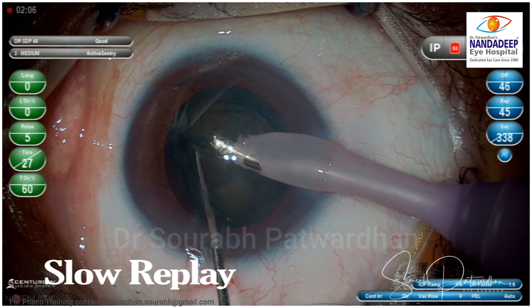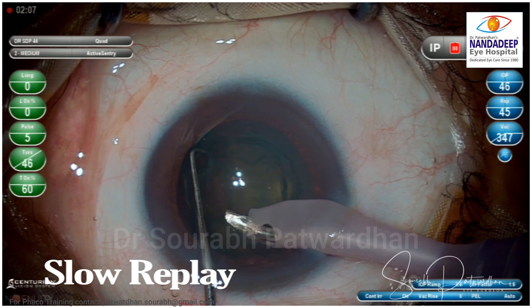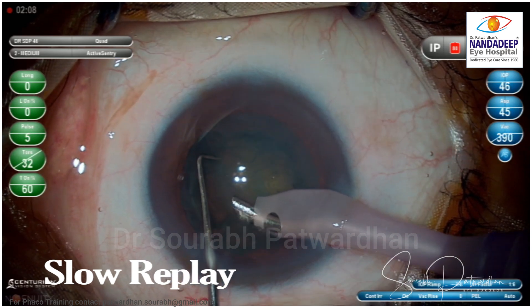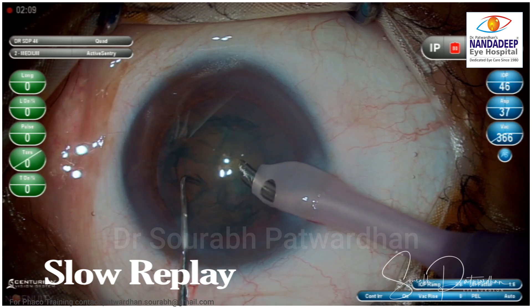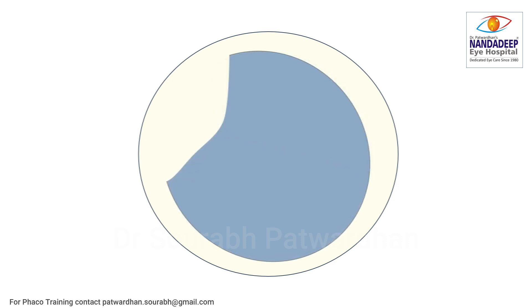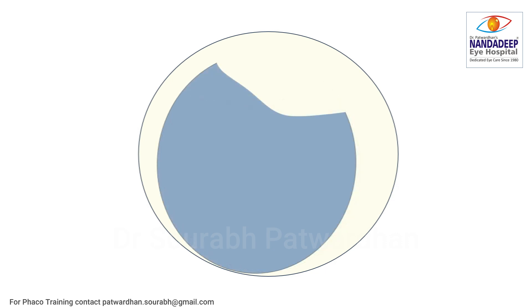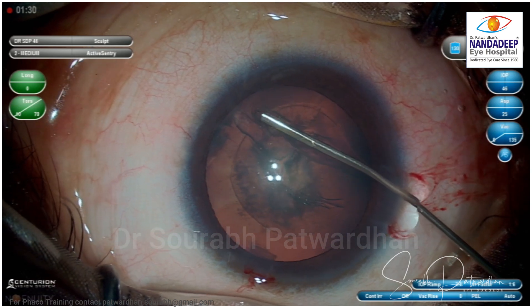Once you remove this peripheral rim of the nucleus, what we are basically doing is reducing the size of the nucleus. Once you have reduced the diameter of the nucleus, you have a bigger bag and a smaller nucleus piece, so you can rotate this piece easily and do the aspiration much more easily. That is the trick behind doing a quick feco aspiration — trim out the peripheral part of the nucleus which is between your second instrument and the feco tip.